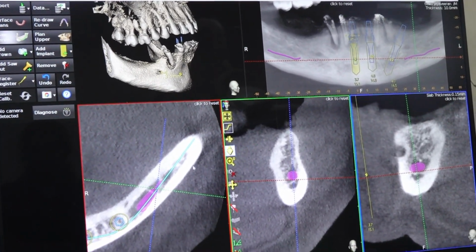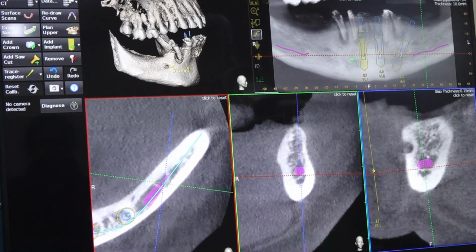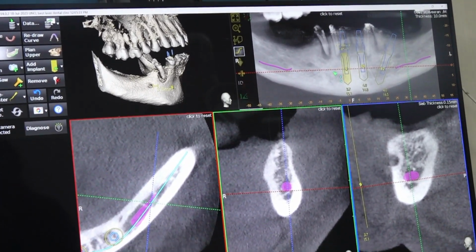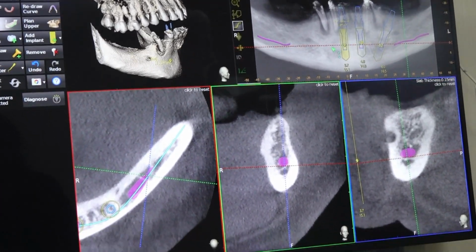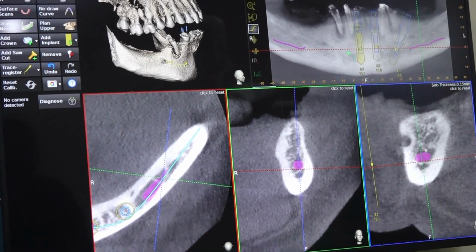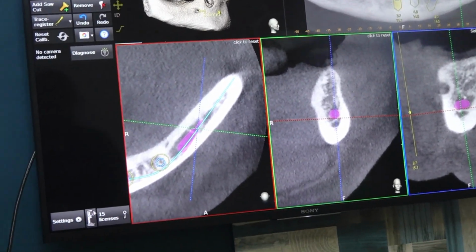So our final plan is we are planning for an all-on-4 type with single piece multi-unit implants with the titanium bar with the cantilever, giving only premolar. Then during the durable prosthesis we will be giving molar.